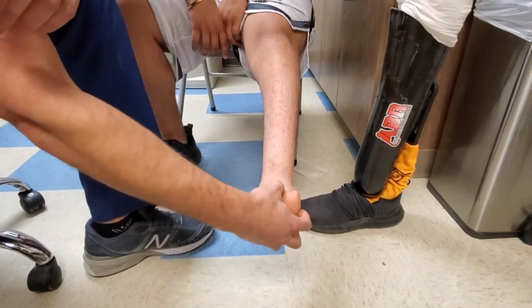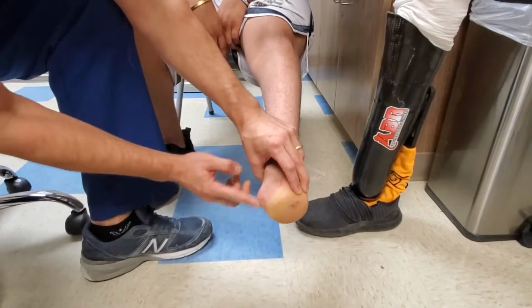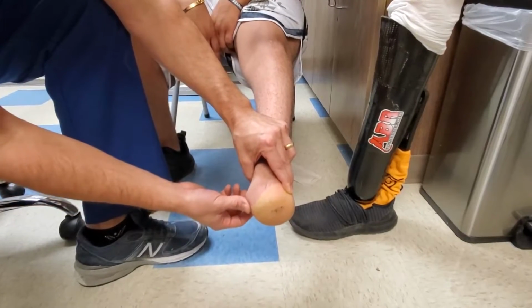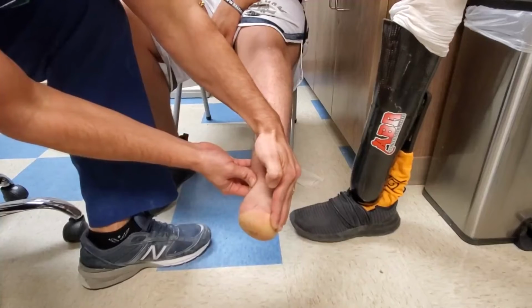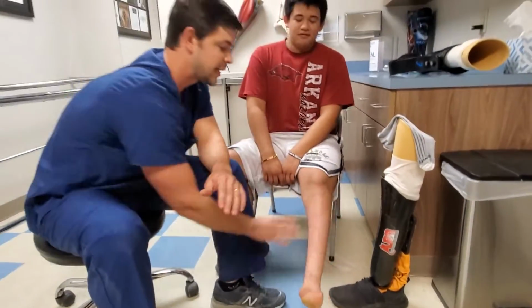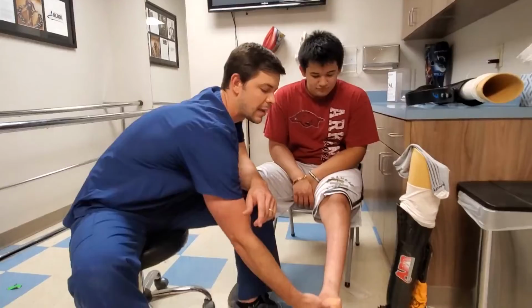A lot of times these heel pads start to migrate and slip laterally or other directions, and it exposes the distal malleoli, and this becomes a pain point for people with it, and then you have to modify differently to allow this heel pad to go back to being in the distal position so they can utilize this tissue down here. And so I'm pleased that he has this nice Syme's amputation. He can distal end bear, and his heel pad is not mobile.